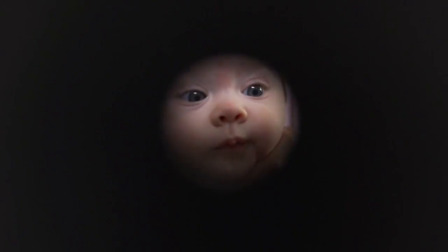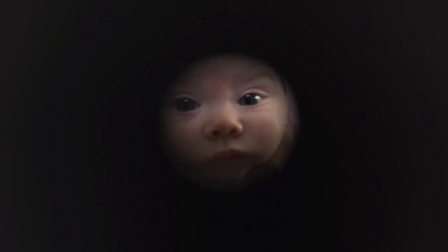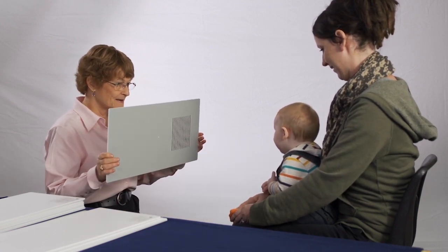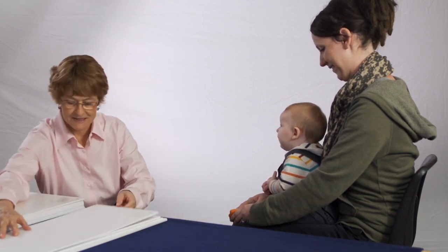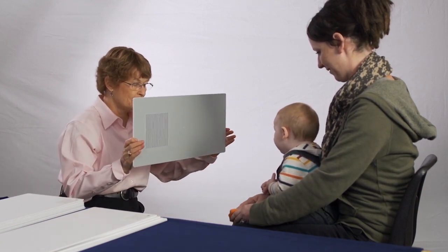There is a small hole in the center of the Acuity card through which the examiner or tester can view the patient as they look at the gray card and the grating. The examiner can also view the patient's responses to the gratings by looking over the top of the card. The examiner is able to change the card position to judge where the grating is located, right or left, based on the patient's visual behaviors, such as looking towards the right or left, or pointing, or other behaviors.